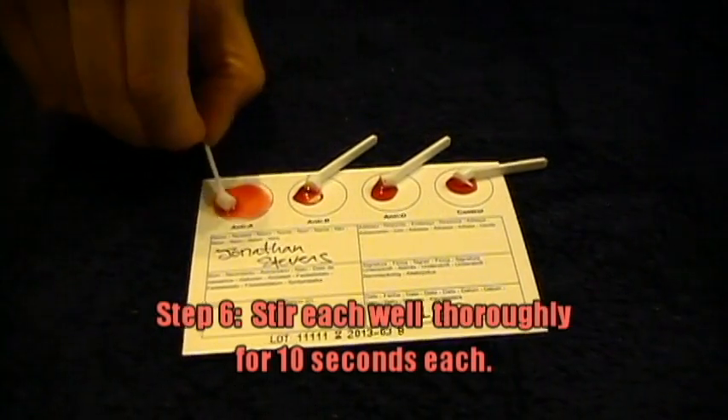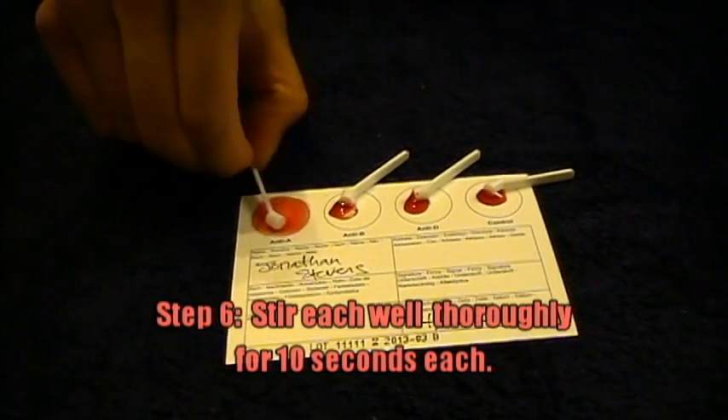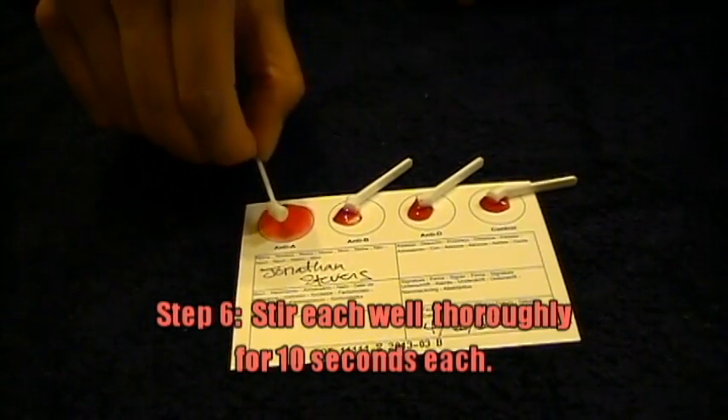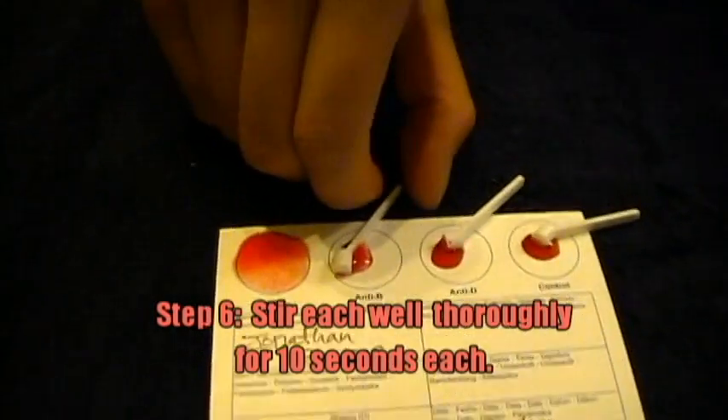Two, three, four, five — this is all the way — six, nine, ten. I already see it starting to clump. Agglutinate is the correct usage.